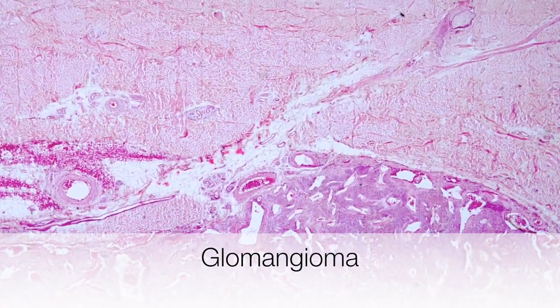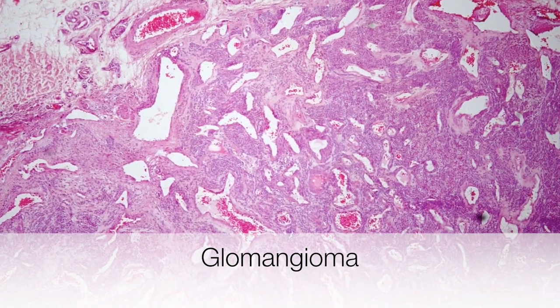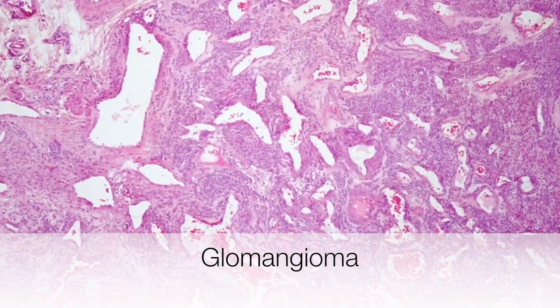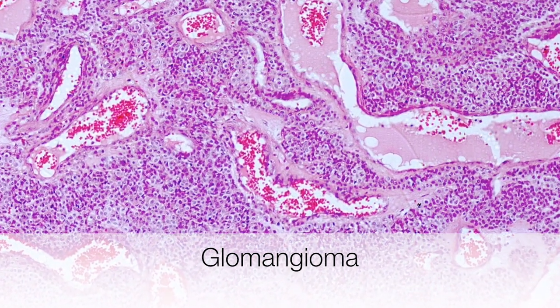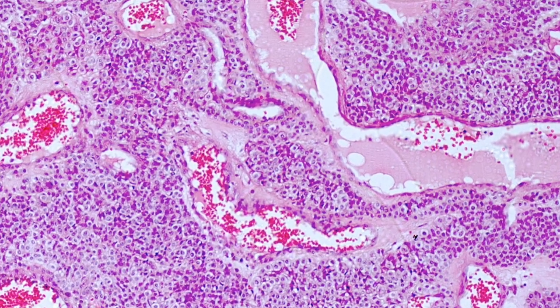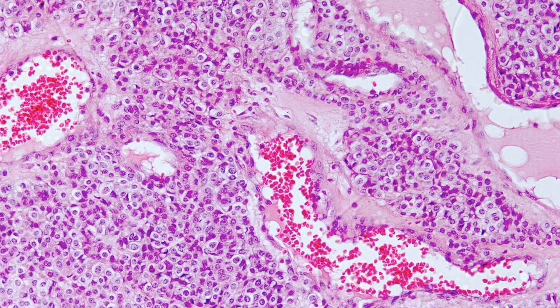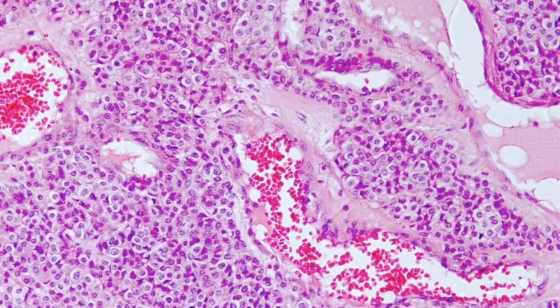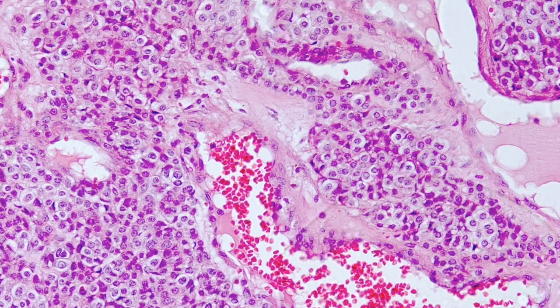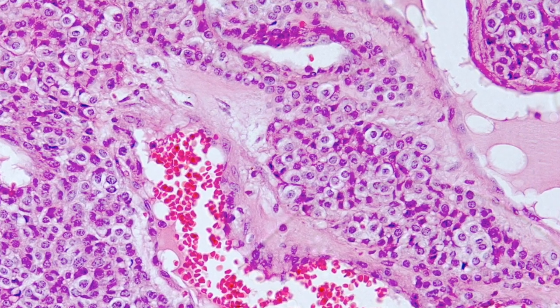This example has a prominent angiomatous component and is a glomangioma. There is a prominent network of dilated ectatic thin-walled blood vessels, and between these there are sheets of glomus cells. As in the solid glomus tumour, the glomus cells have pale pink staining cytoplasm, regular round or oval nuclei, and distinct cell borders.